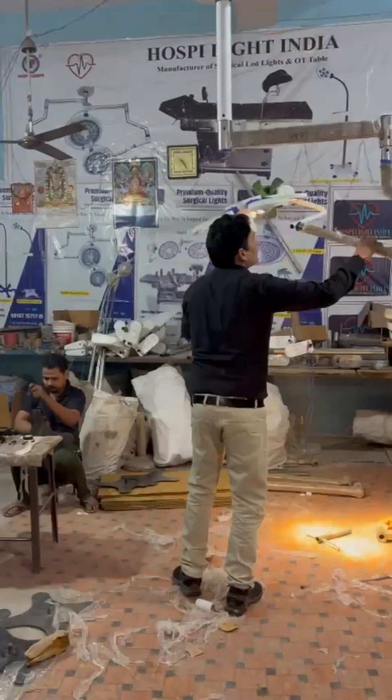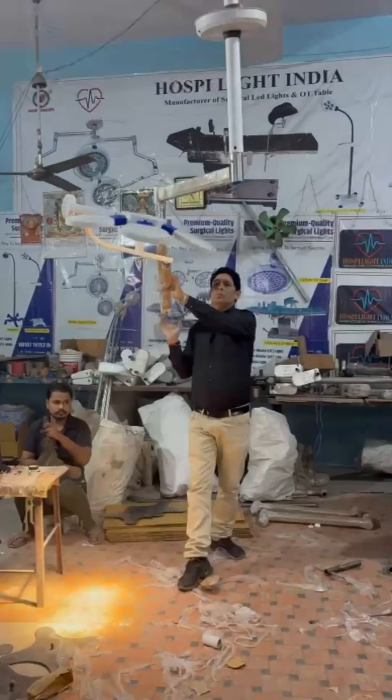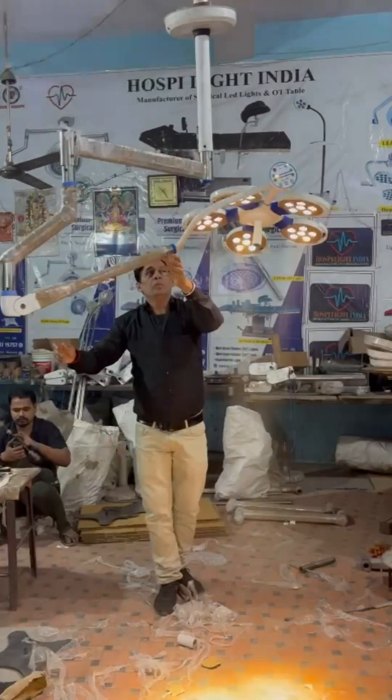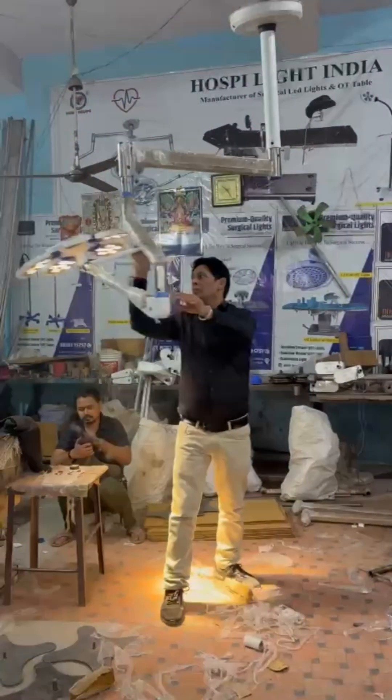LED technology is LED bulb. You can fully rotate this light 360 degrees with no break in this light. The light is made of stainless steel and a dome aluminum body.